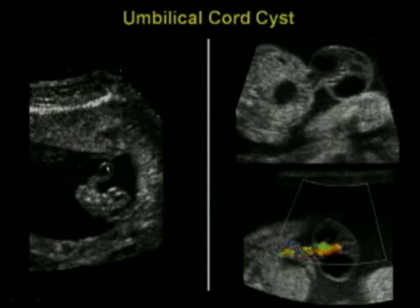First trimester, there's the head and body of the fetus, a bit of the umbilical cord, and there's a cyst in part of the cord. Here is another case. This is in the late second trimester, and what we're seeing is the fetal abdomen. That's actually the fetal bladder. You can see a little bit of normal cord, and then this part of the cord here, there are two big cysts. There's one, there's the other. On color Doppler, the cord vessels light up, the cysts do not.